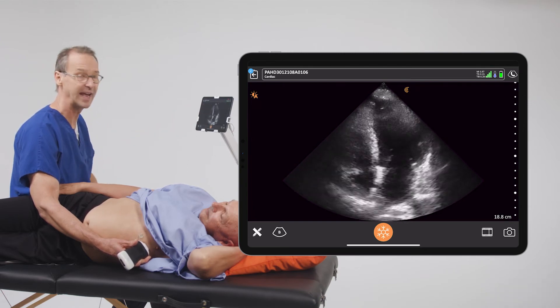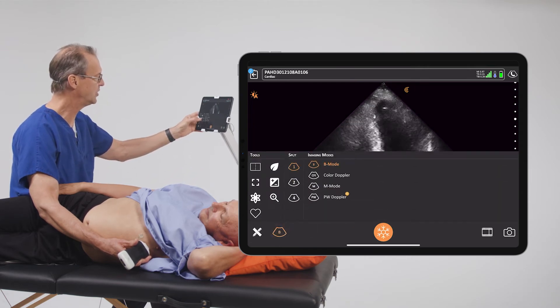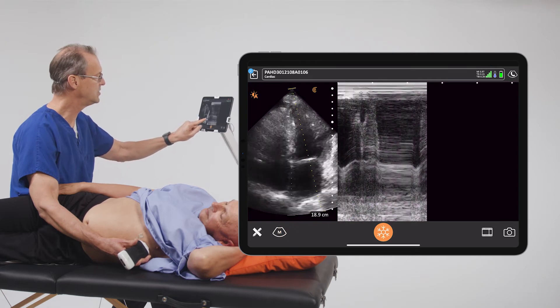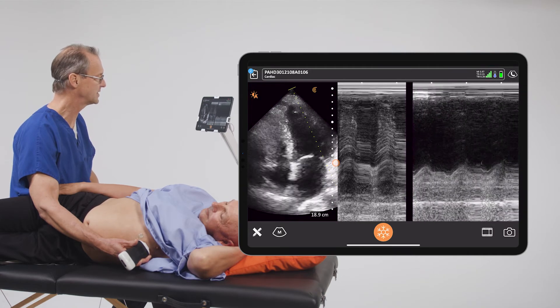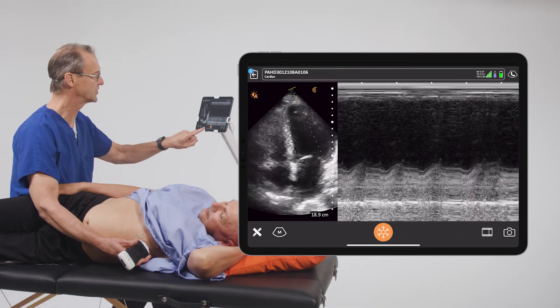It moves towards and away from the apex of the heart. To do this, we're going to go out of B-mode into M-mode and take our M-mode cursor and move it so that it goes over the mitral annulus — the lateral aspect of the mitral annulus — and we're trying to get the waveform that you see here on the screen.